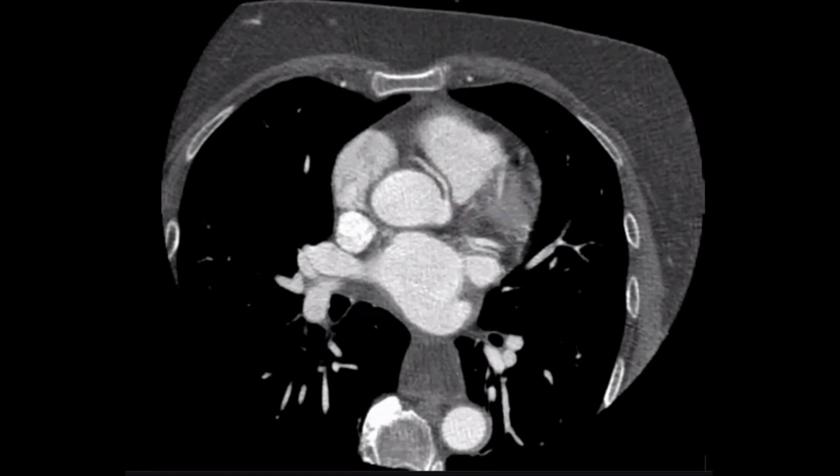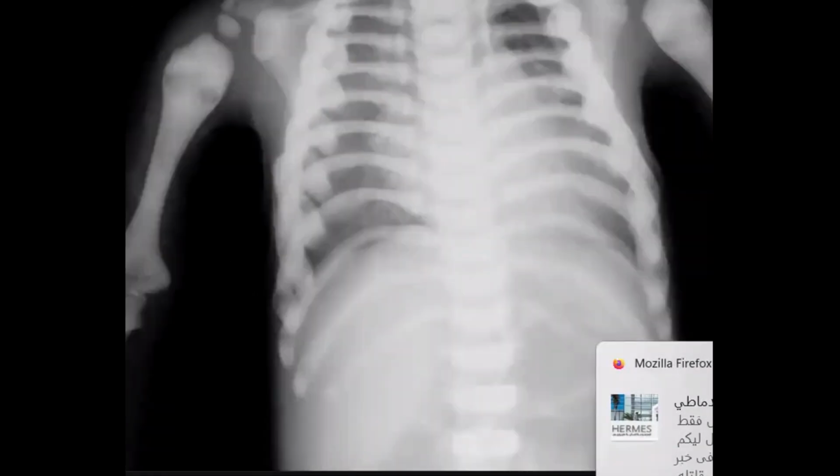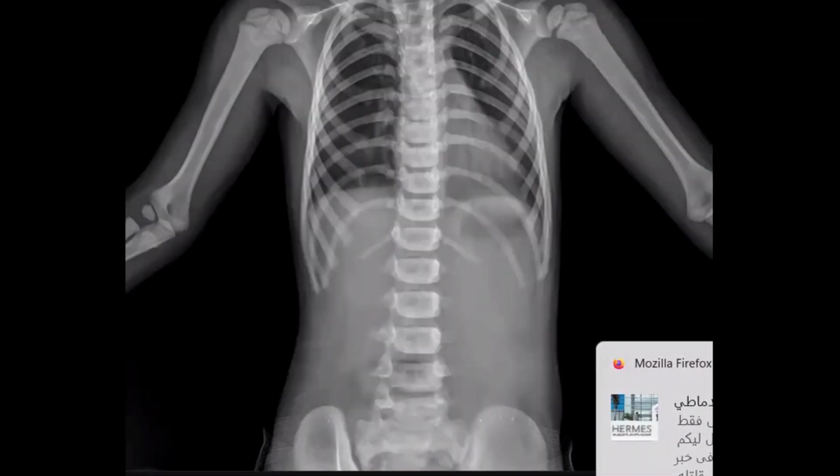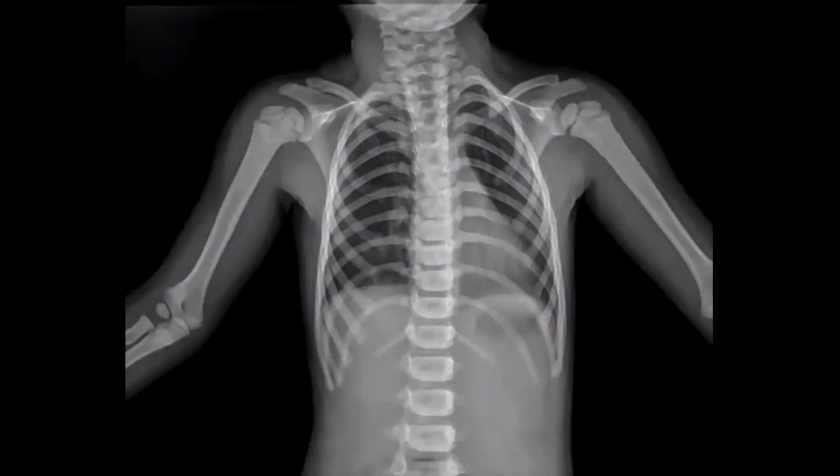Okay, very nice. This is the frontal. I'm sorry, just a minute. I am sorry. Okay, I don't know why it's this case. Anyway, let's see what you have.